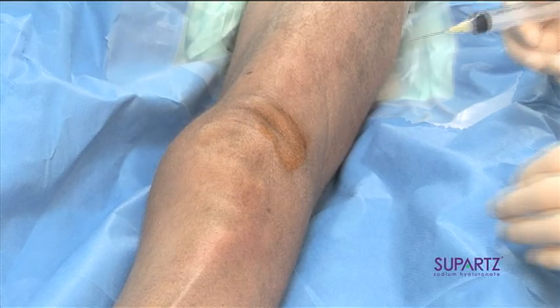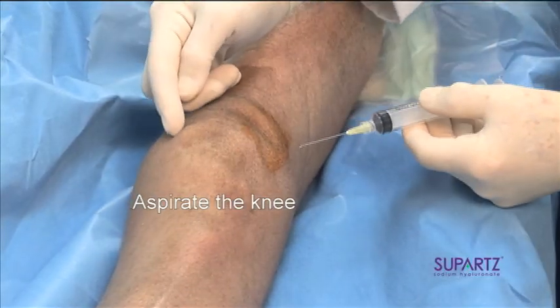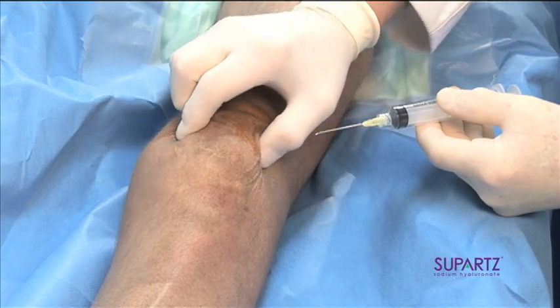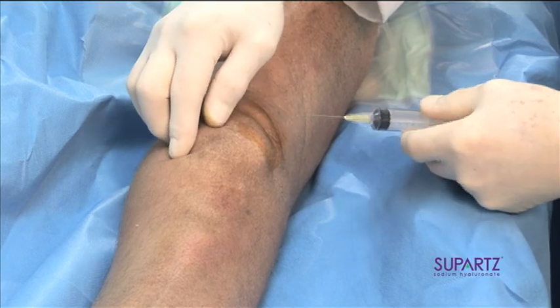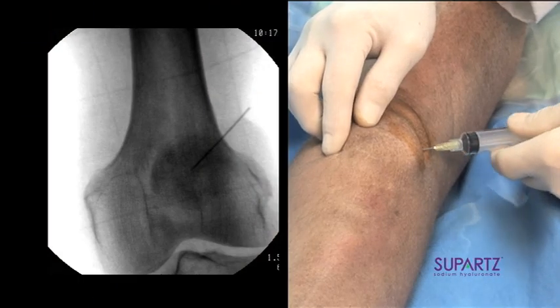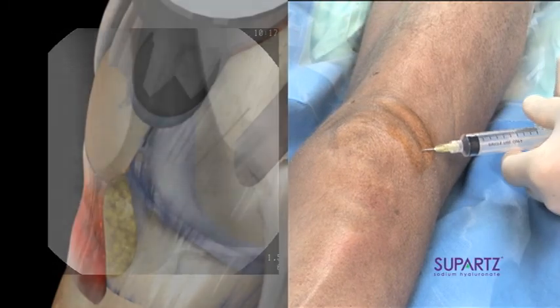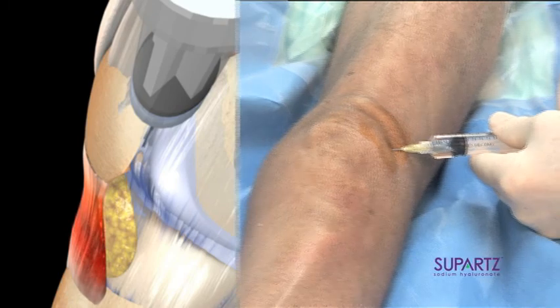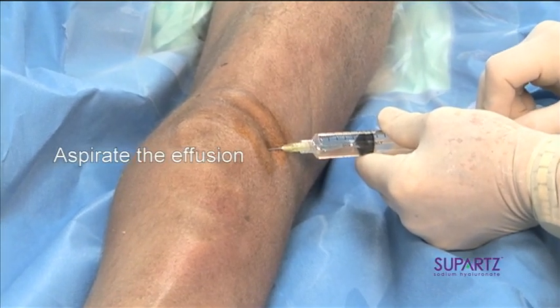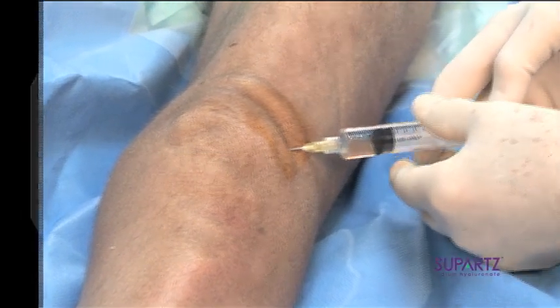Now we're going to aspirate the knee. We will push the patella laterally so that we can feel the edge of it, because what we want to do is get right underneath that center portion of the patella so that we can aspirate the effusion. This patient has a pretty fair effusion in the knee.